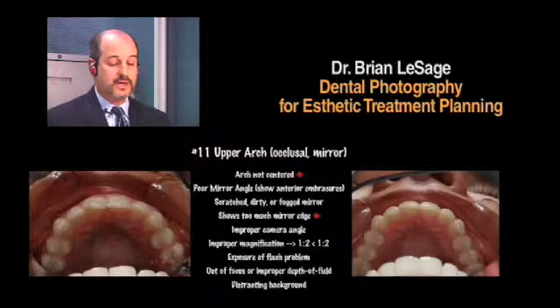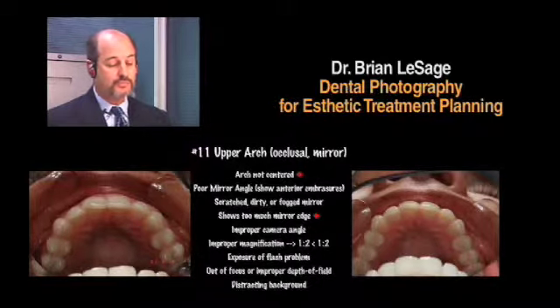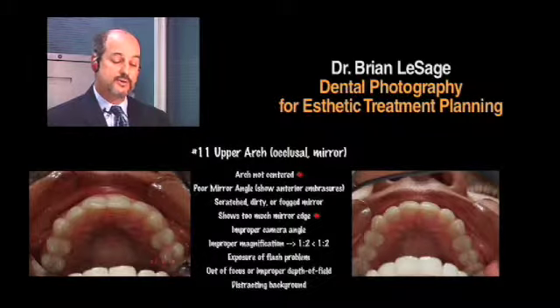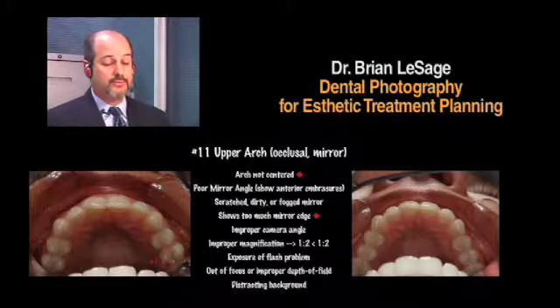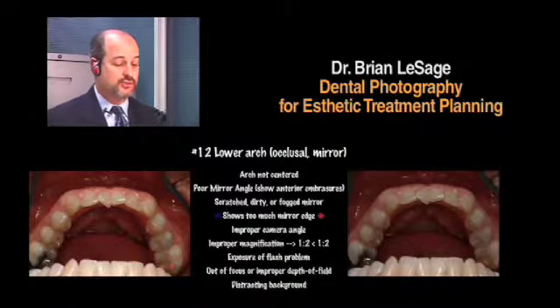Some people like to shoot these occlusal views seated up. Some people like to shoot them lying back down. I personally do them lying back down, but it's whatever your personal preference is. I don't think there's a right or wrong way to do it. It's whatever is easier for you to manipulate, hold the camera, and get the proper view. That's all I care about, and that's all you should really care about.